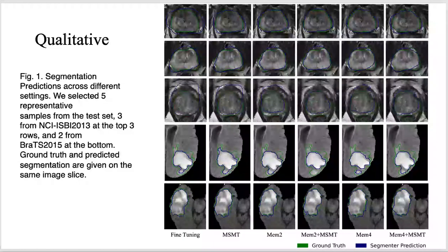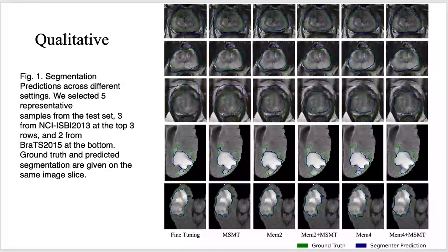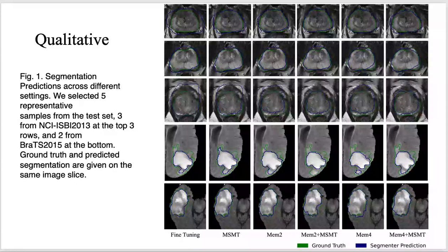We also provided qualitative evaluation to compare segmentation predictions across different settings. For samples from the NCI dataset, we see consistently that MSMT helped to generate more precise predictions regardless of whether rehearsal is involved in training. For the first and third sample, MSMT significantly mitigated over-segmentation. From the second sample, we see that MSMT could push the segmentation to align better with detailed structures along with the target boundary.